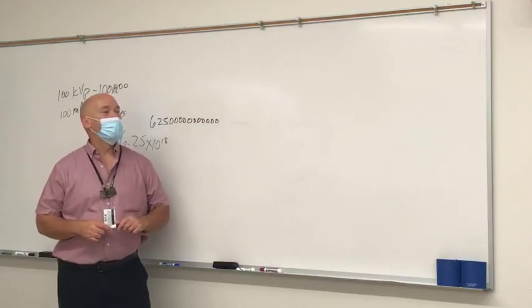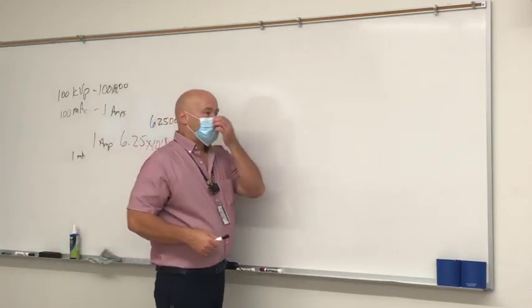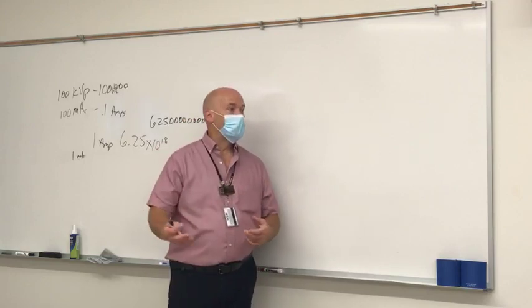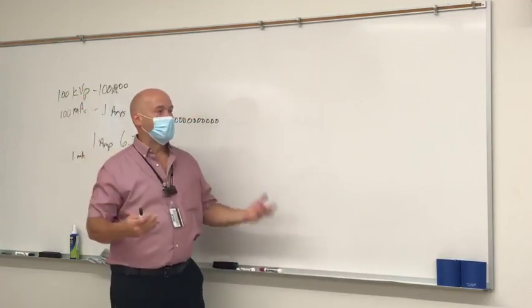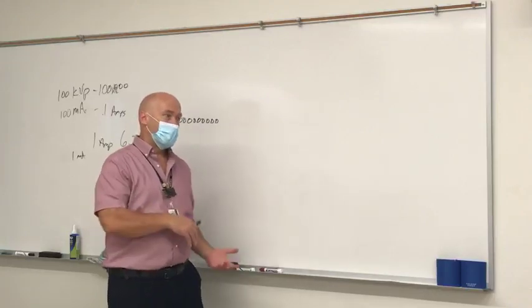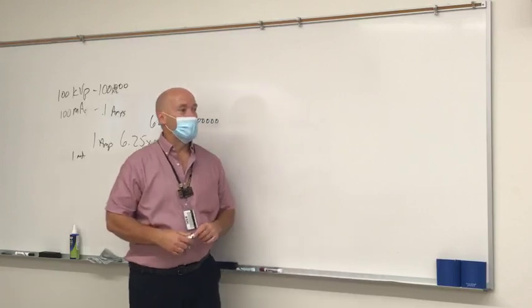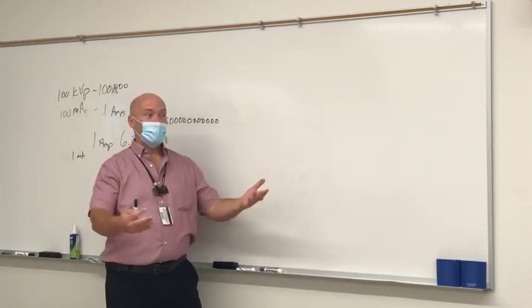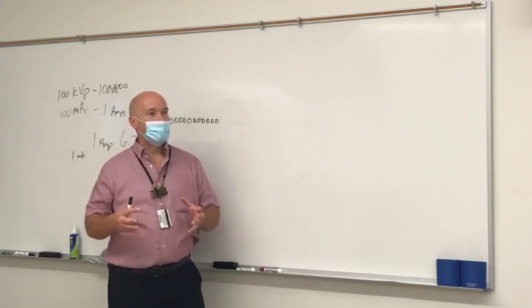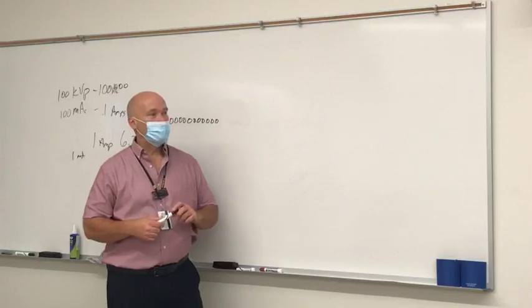Well, so this thing can only be used so many times before it. Yeah, the number of times it can be used depends on the kVp and the mA we use. If we use a lot of high kVp and low amperage, it'll last longer. If we use low kVp and high amperage, we'll burn it up a whole lot quicker. And we're gonna talk about that too, specifically what things lead to tube failure. So we're gonna learn about that this semester as well.